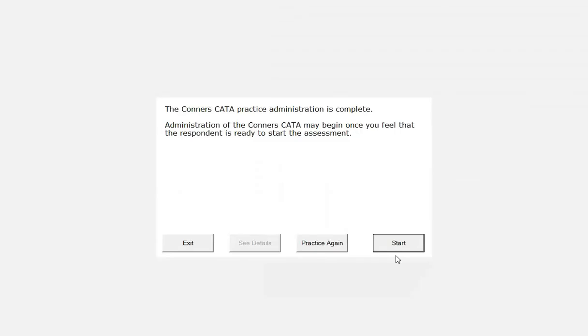Upon completion of the practice test, it is up to the administrator to decide if the respondent should proceed to the actual administration. Just like the Connors CPT-3, the Connors CATA will provide guidance.